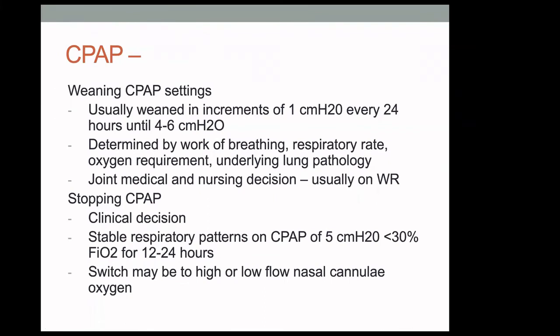So when babies are doing very well on the CPAP, it can often be weaned, but we do recommend that you do this slowly in increments of about 1 centimeter of water every day until you reach about 4 to 6 centimeters of water. And you would determine how to wean clinically by your work of breathing, respiratory rate, oxygen requirement, and also the underlying lung pathology. And it's a decision that should be made with the nurses and usually on the ward round.